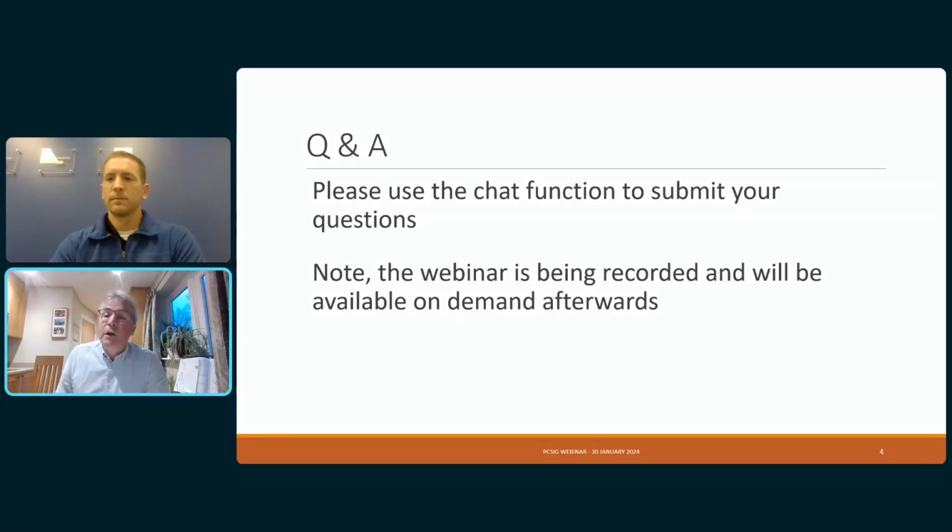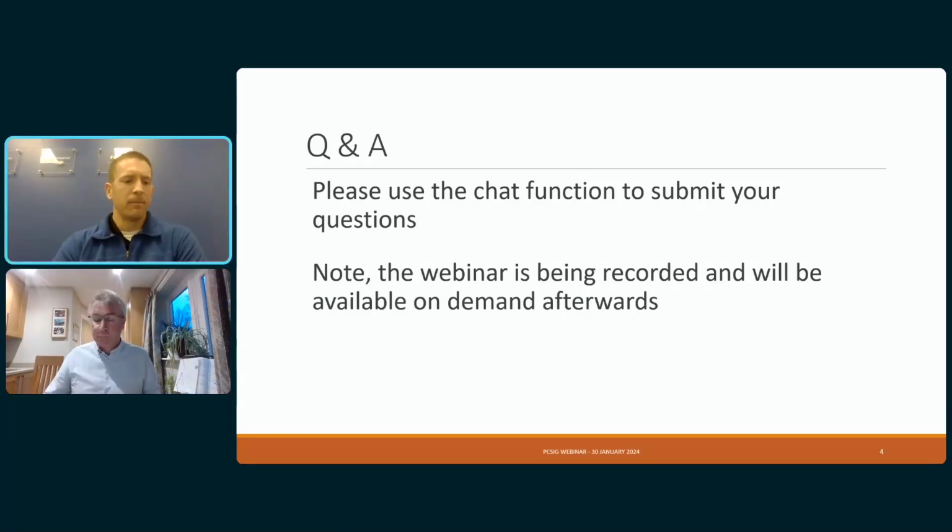Question from Aziz. Do we need to test hematocrit effect while the volume of blood spotted is fixed and accurate? So I think what it's saying is, now we're collecting a fixed volume of blood, why are we still testing the hematocrit issue? I think the hematocrit issue is more on the analytical side than the loading side. The 25% hematocrit almost looks pink, whereas the 65% is a very, very dark red, almost a brown. And so when you extract those samples, you might pull some of those constituents off that then cause a matrix effect during your analysis.